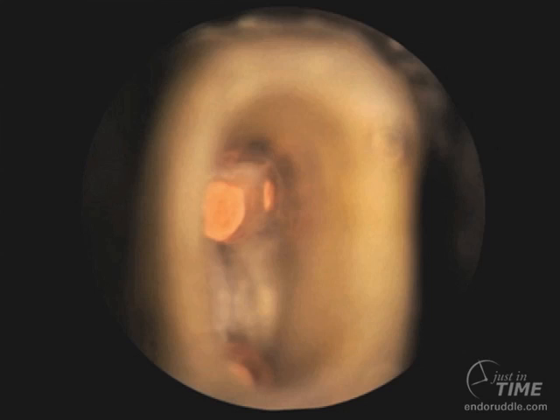Now in this particular tooth, this is a high magnification view through a microscope, and I'm looking up into a cleaned out pulp chamber, and we've left a post space in the buccal branch. If you look in the wall of that canal coronal to the gutta percha, you can see a pink circle in the lateral wall of the shaped canal.